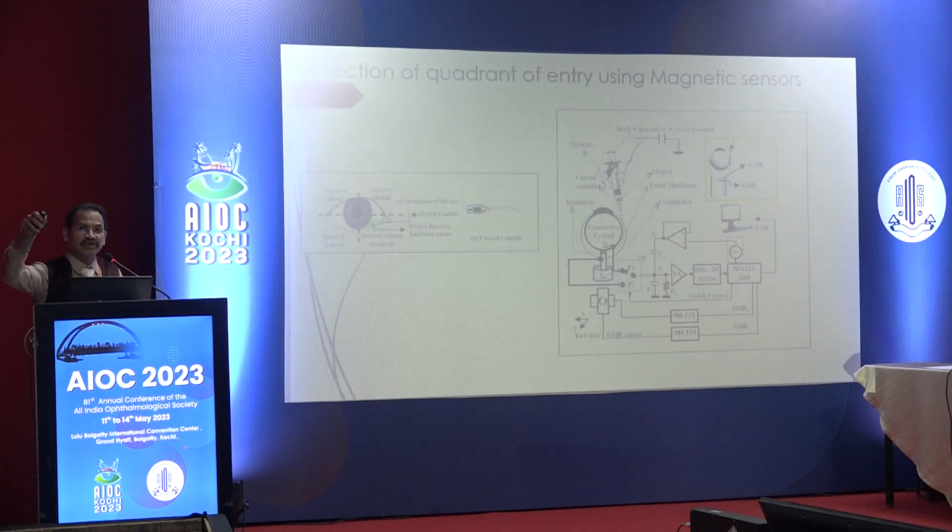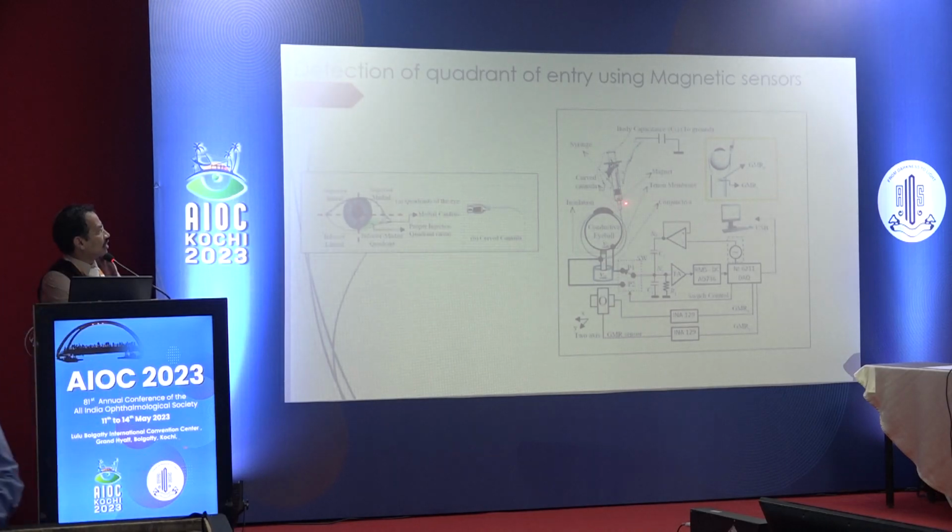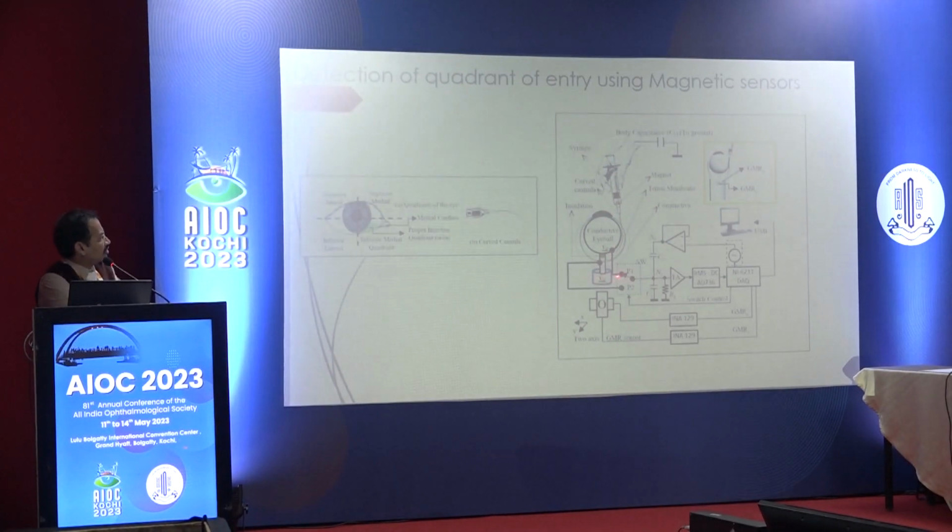Unfortunately, the pointer is not working. We have placed a magnet here in the syringe, and the magnetic sensors are placed here at the eye holder.